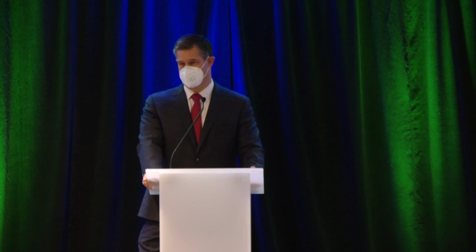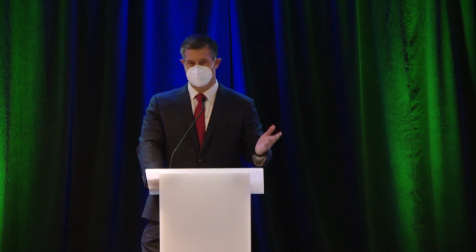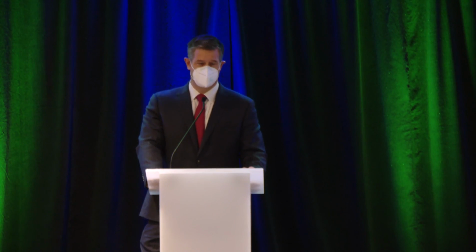That's question number one. Question number two, not uncommonly you'd see the stomach is pretty pressurized, and when you put your gastric marker in that area, I feel it affects your IRP measurement. So how do you go by that? Do you disregard that and say, I don't believe the IRP here, and I'm going to move on to barium esophagram with tablet, with or without EndoFLIP? Thank you. Great questions, because that scenario is not uncommon, and actually it's very much related to the previous discussion about the technical quality of the study.